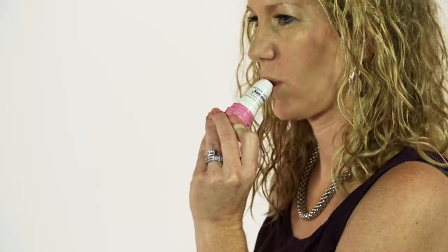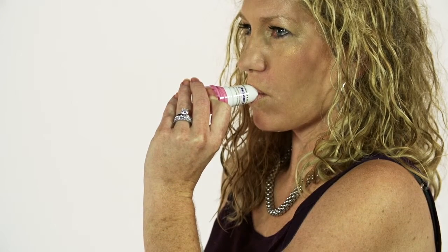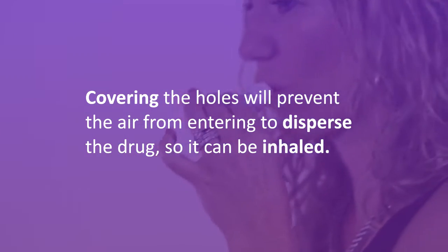Bring the Twisthaler to the mouth. The device is now in a horizontal position. Be sure to have fingers clear of the ventilation holes. These are the air inlet holes — covering the holes will prevent air from entering to disperse the drug so it can be inhaled.